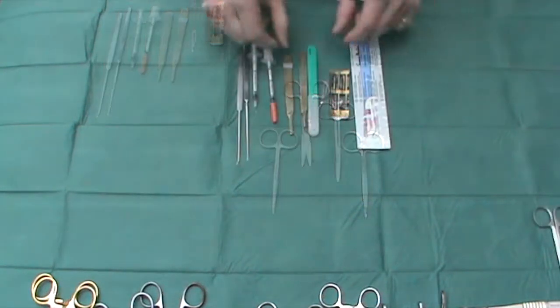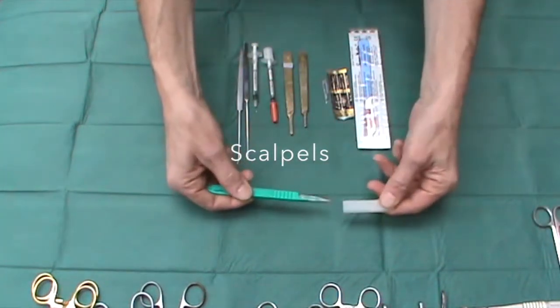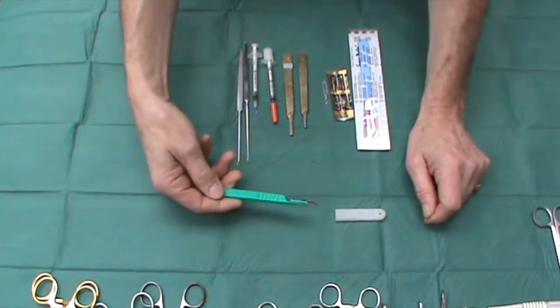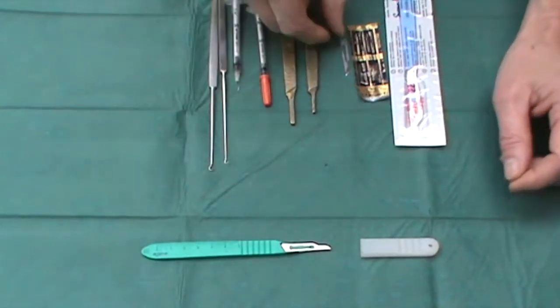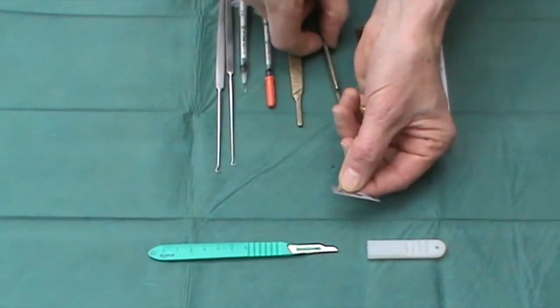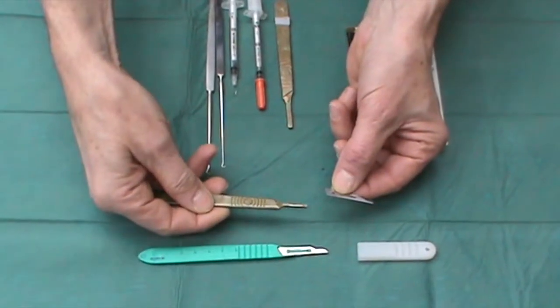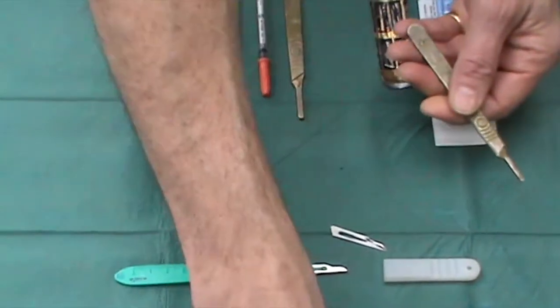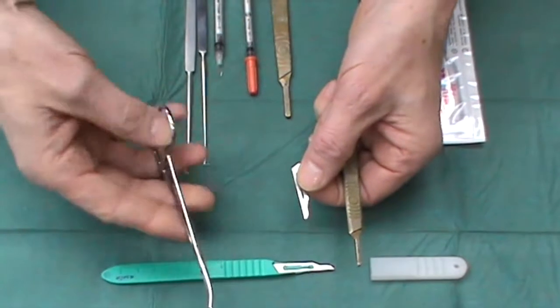When it comes to scalpels, the most often used blade is the number 15 blade, here on a disposable handle. These are fine; however, often better and sharper is to use a carbon steel, as opposed to a stainless steel, on a reusable handle.